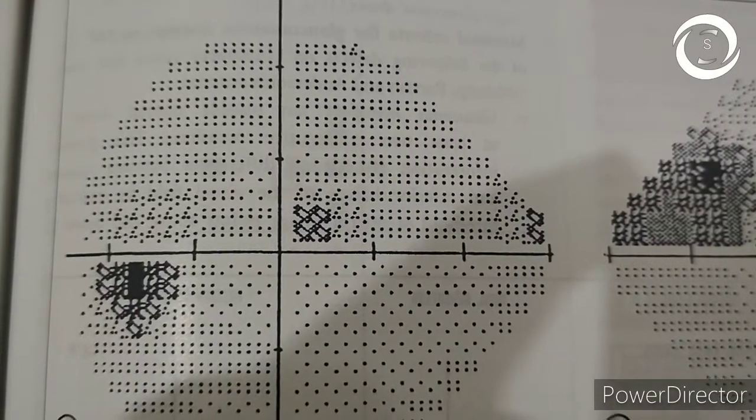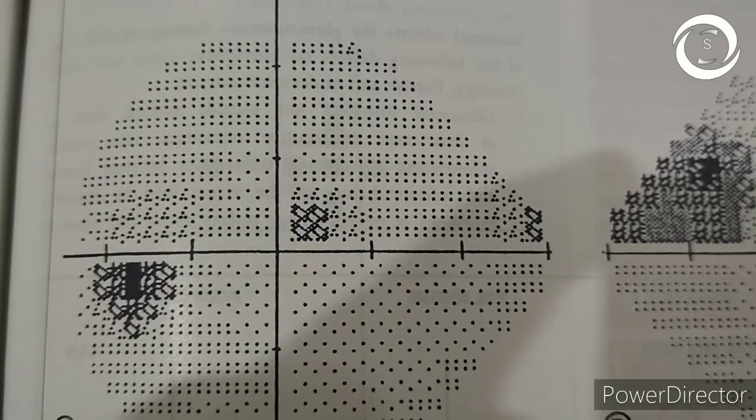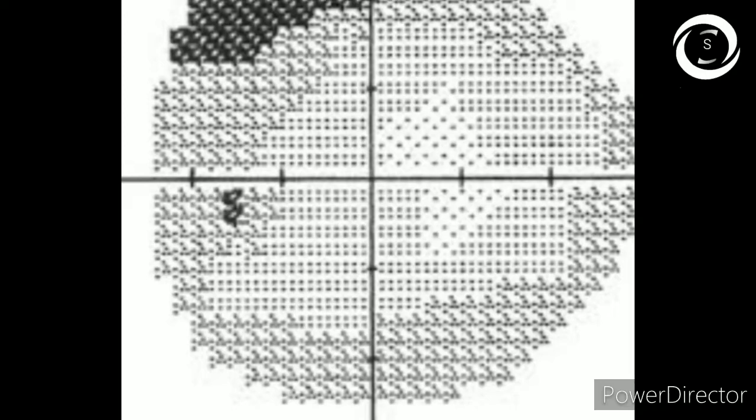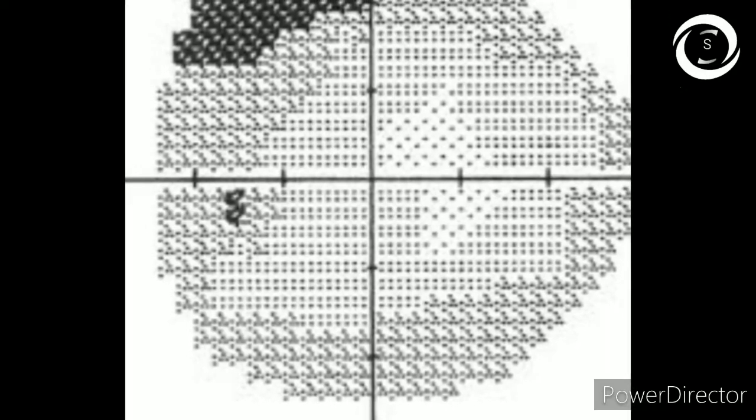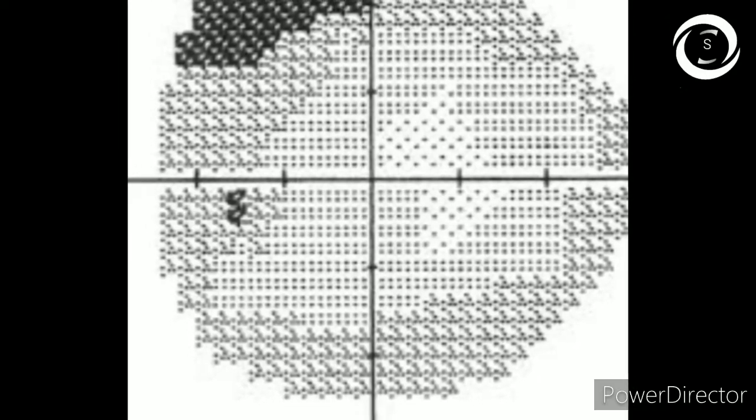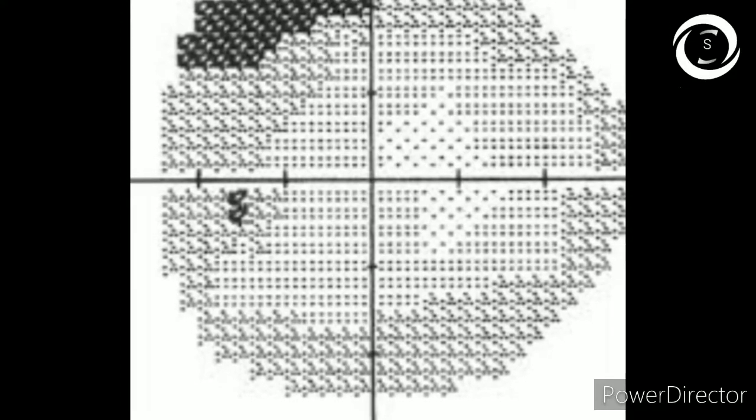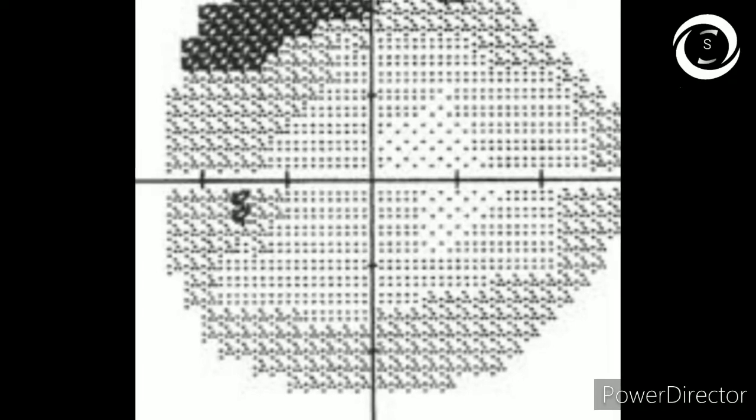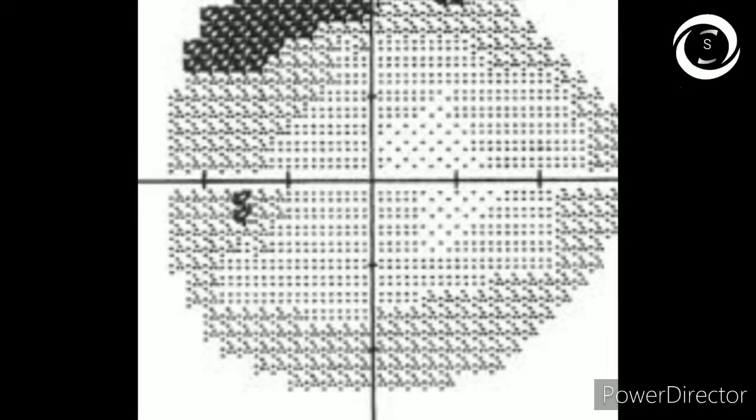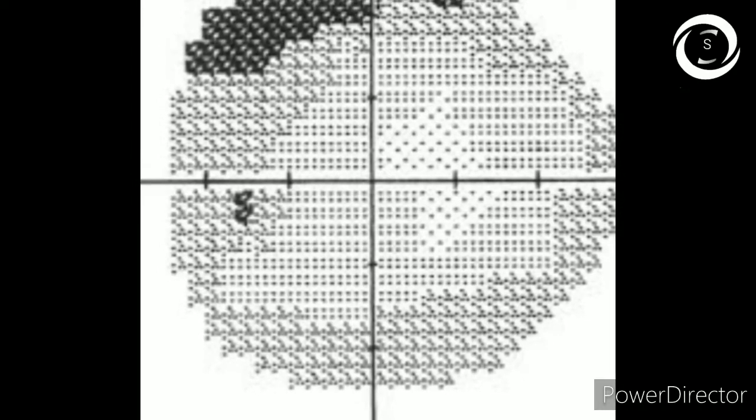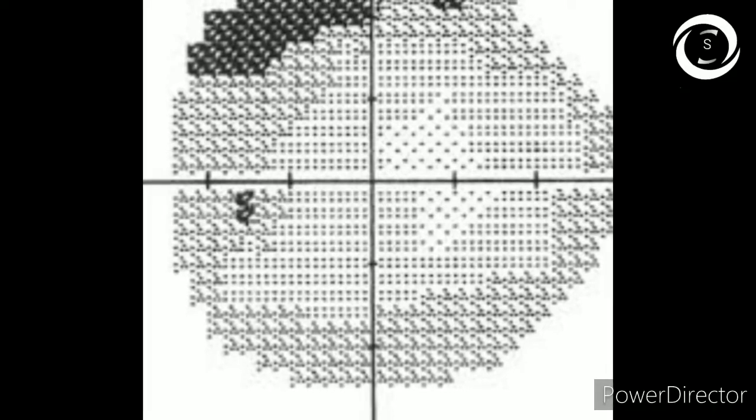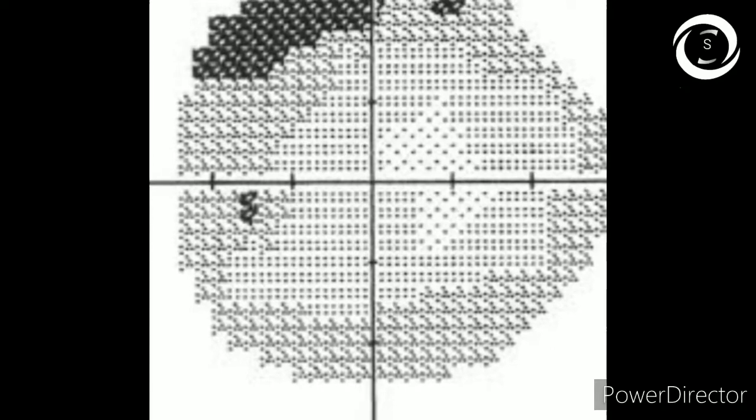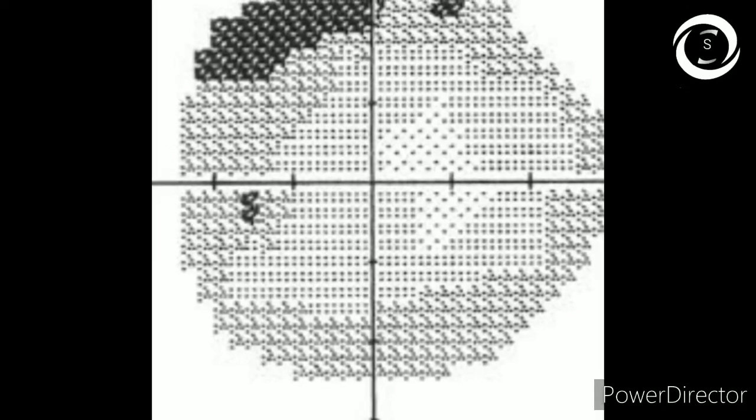Now look at the temporal wedge defect. How to differentiate temporal wedge from nasal step? Orientation of the visual field chart is very important. First locate the blind spot. Here it is on the left side. The blind spot is always in the temporal field, so the wedge defects are also in the temporal field. You can see superior temporal wedge defect clearly.